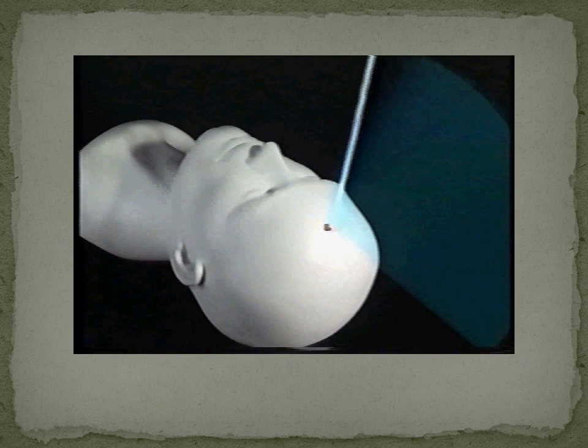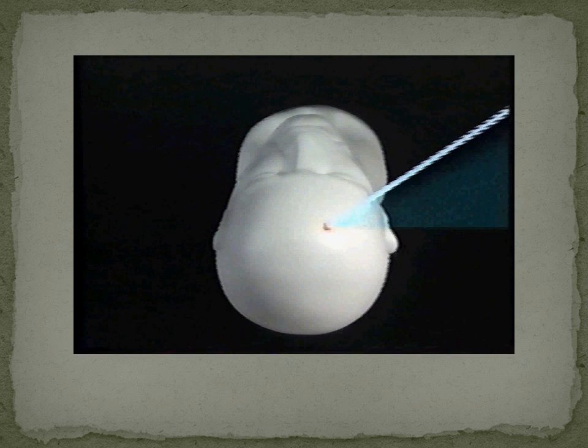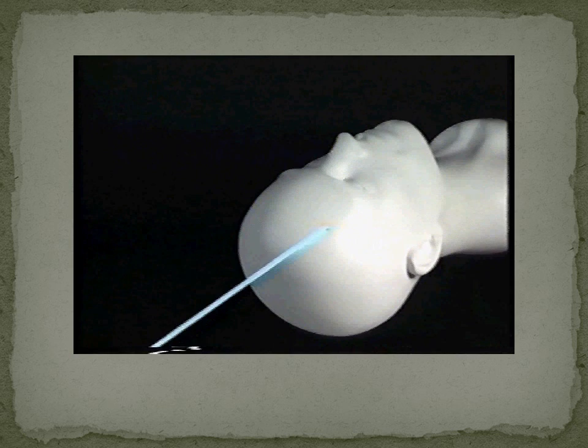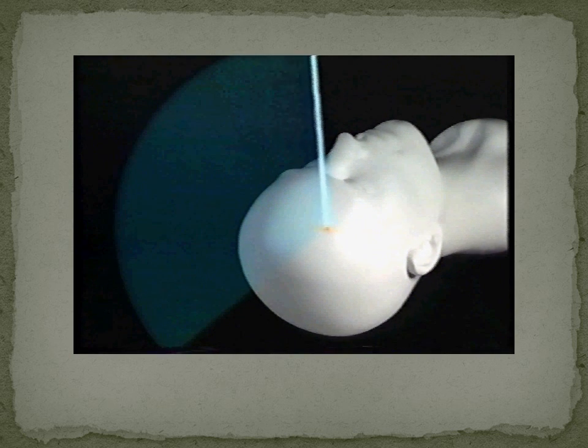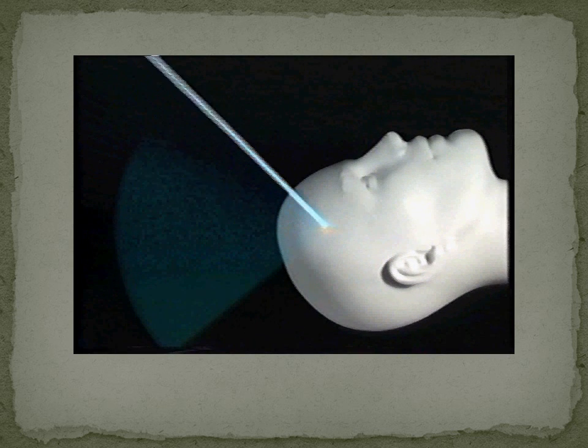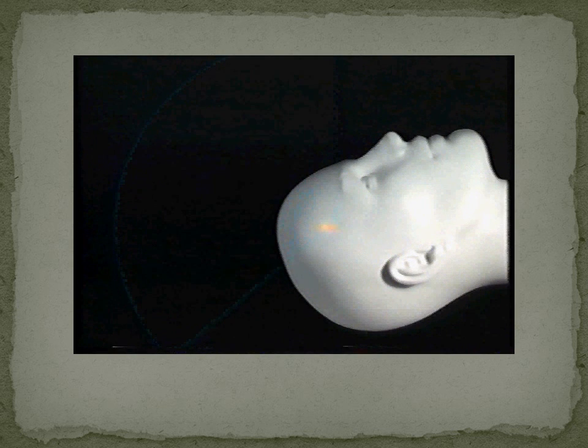Okay. This just shows you how we actually do this. Here's an arcing plane. We arc the patient. Then we rotate the patient because we can't rotate the machine very well except in one plane. And so by moving the patient into multiple arcs, we go ahead and actually spread these entrance doses around the patient.